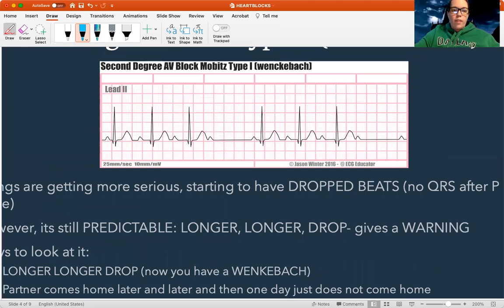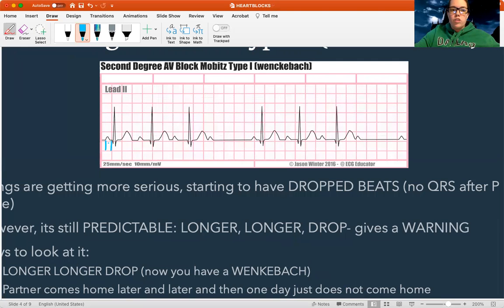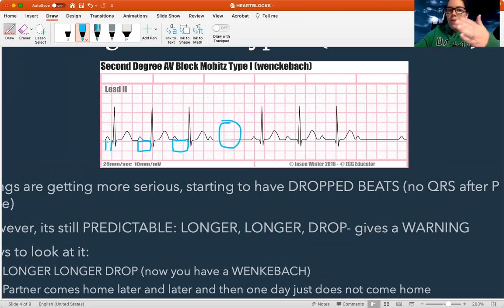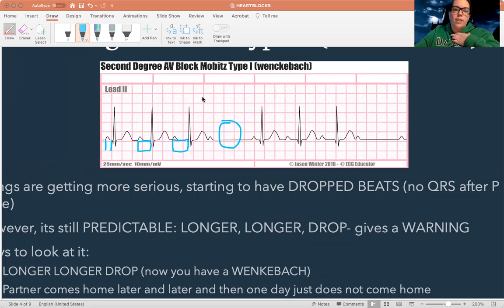Looking at this rhythm, we're looking at the PR interval — and by the way, with all the blocks, we're going to be staring at the PR interval. The pattern to a second degree type one is there's a lengthening PR interval: normal, longer, longer, drop. The fun little rhyme to remember this is 'longer, longer, drop — now you have a Wenckebach.' And whoever named this rhythm had a weird, crazy name.